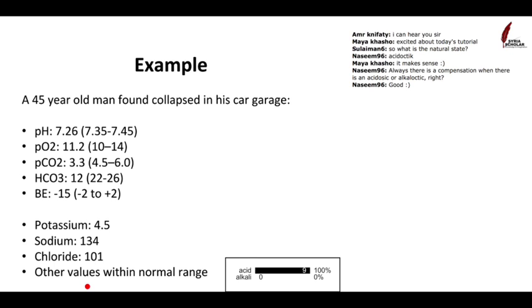Okay, so he's acidotic. The second question in our system is, does the CO2 explain the pH? Is this acidosis explained by the CO2? Okay, so people are saying it's not explained, and that's correct. If the CO2 was causing the acidosis, the CO2 would be high, but the CO2 in this case is actually low. So this is not a respiratory acidosis. In that case, is the pH explained by the bicarbonate? That is the third question in our system.